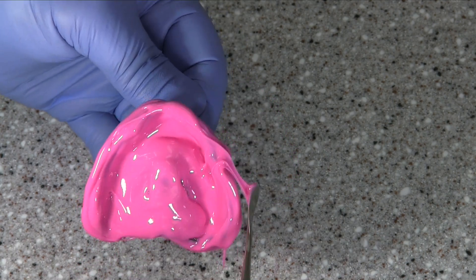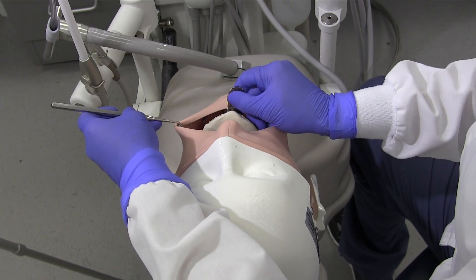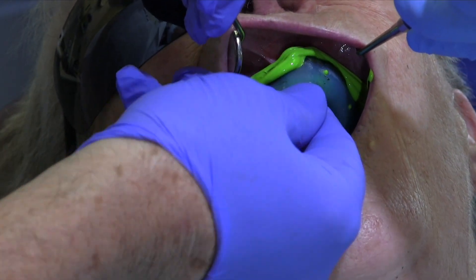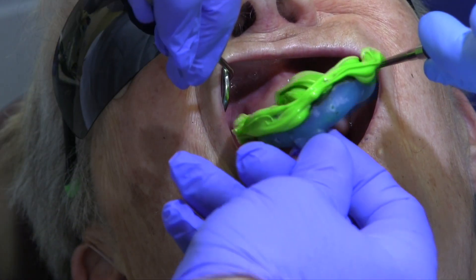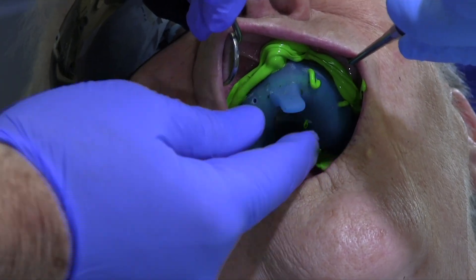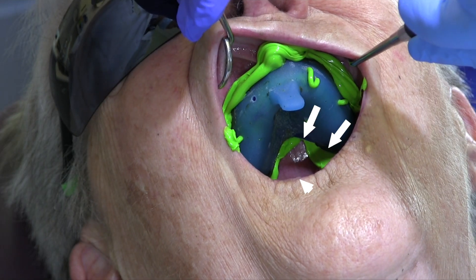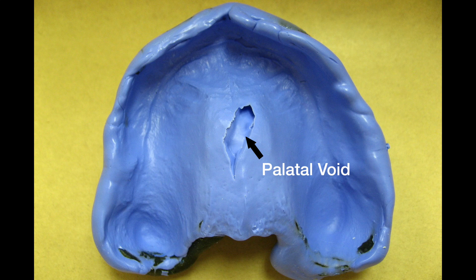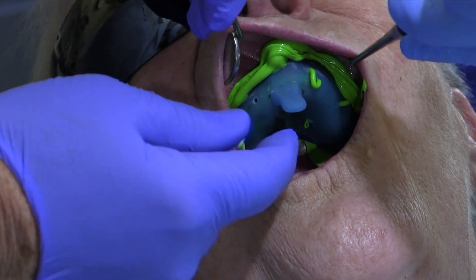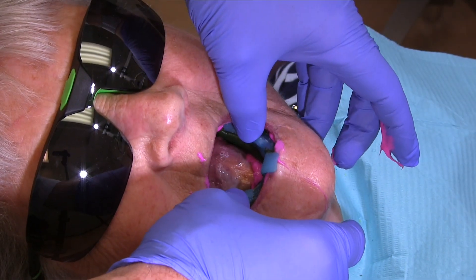Use a number 7 spatula to quickly smooth and pull material over the borders if necessary. With mirrors in position, place the impression tray intraorally, beginning insertion slightly sideways and rotating it into position. Try to avoid impression material or tray contacting the lips or cheeks. Seat the tray in the anterior region first, aligning it with the labial frenum, and then rotating the back of the tray into place using slight vibration or wiggling until you see a continuous layer of impression material around the entire border of the tray. Seating the impression tray from front to back minimizes trapping air in the palatal vault. If there are any areas without impression material visible, continue to vibrate the tray into place until material becomes visible. Do not remove any mirrors until you see material around the entire periphery.